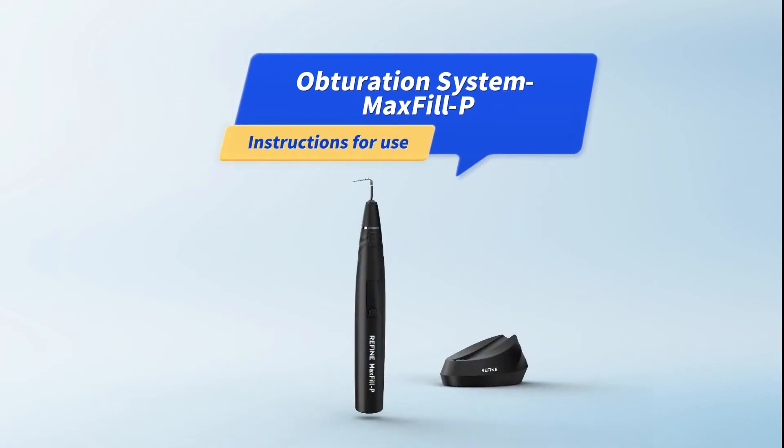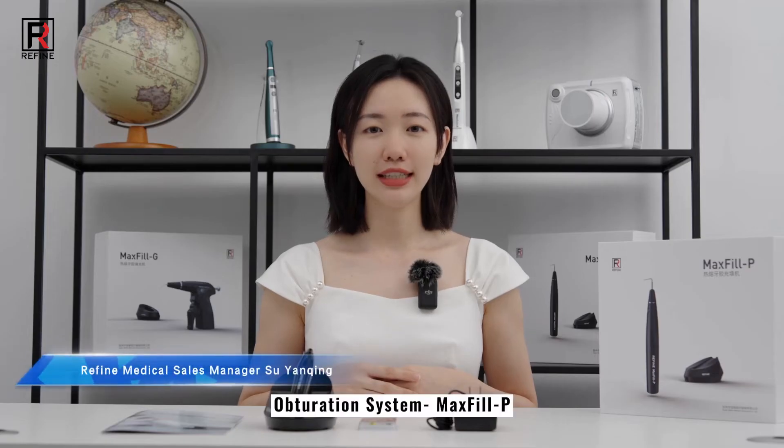Obturation System MaxFill-P. Instructions for use.